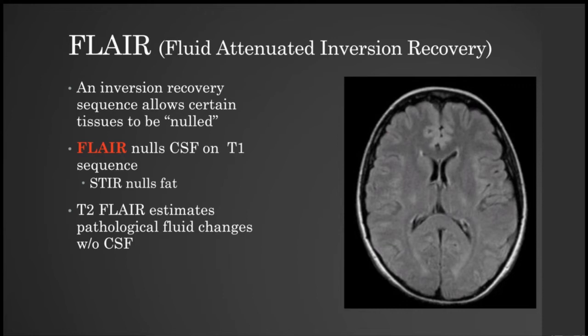FLAIR is kind of an older term in terms of what we get. We probably get T2 FLAIRs more often, and that's what we're typically looking at. But it's just improved algorithms that we can use.